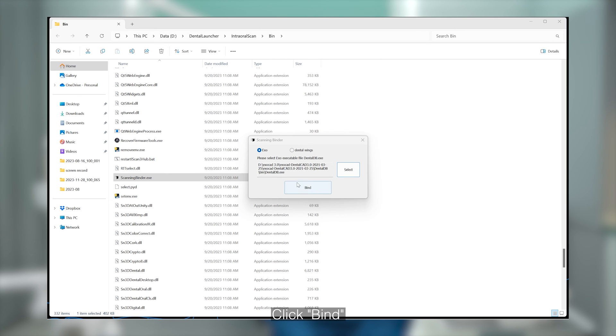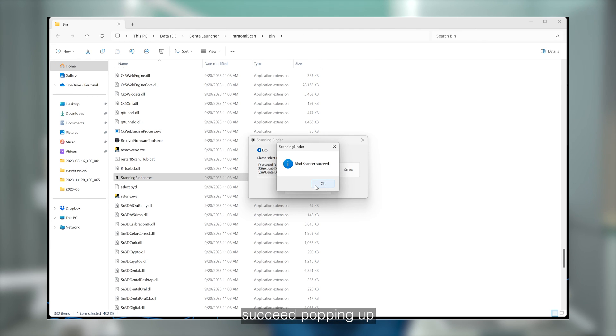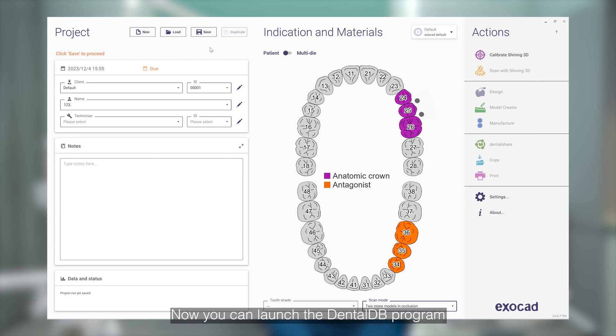Click Bind. Once successful, you will see a "Bind Scanner Succeed" message popping up, confirming the successful binding.